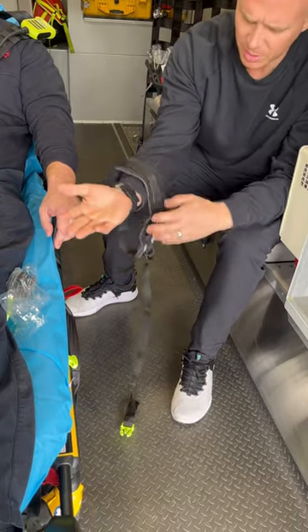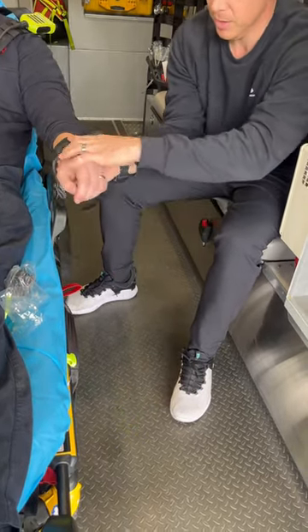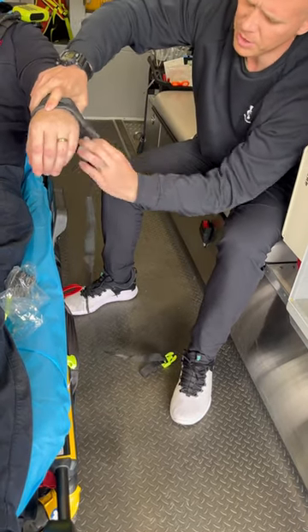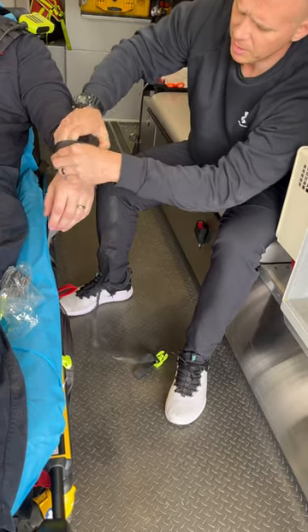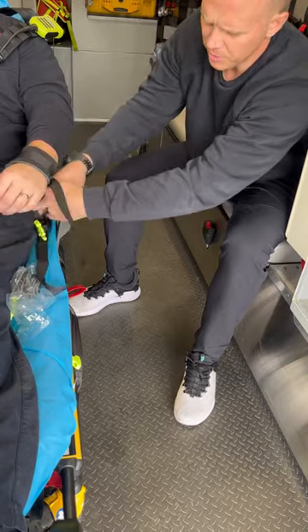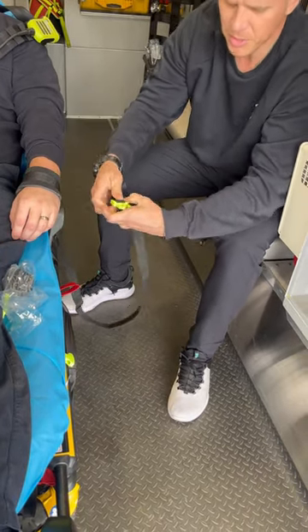The best way to apply this is to put it around your wrist, grab their wrist, feed it through, cinch it up. You can apply a Velcro stabilizer here, which would keep the cuff on there a lot better — cinch it up. It's preferable to go through the expandable patient surface; this will prevent any lateral motion once they're restrained.